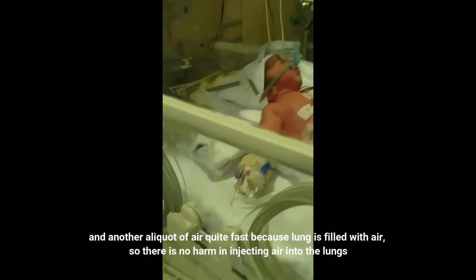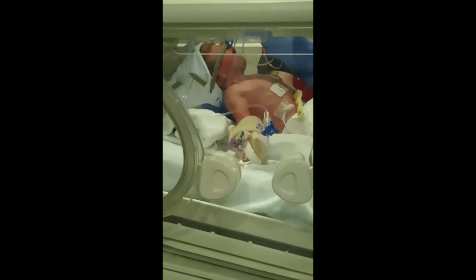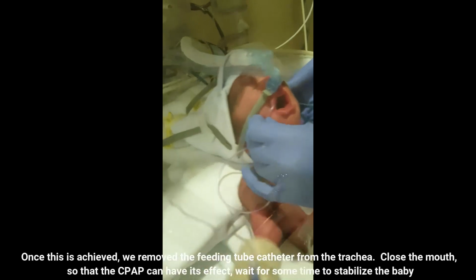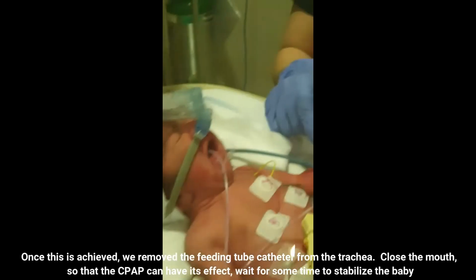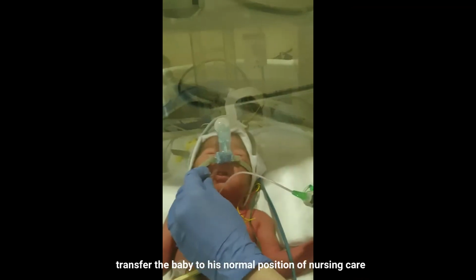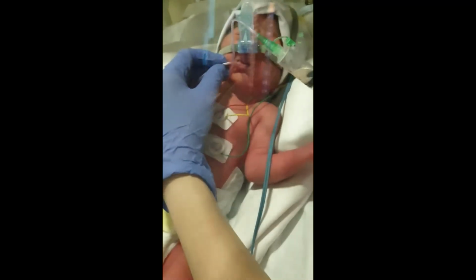But make sure you are not blasting the air into the lungs. As if a baby takes a normal breath, please inject the air. This is to push the Curosurf into the distal airways where its action is needed and to prevent reflux as well. Once this is achieved, we remove the feeding tube catheter from the trachea. Close the mouth so that the CPAP can take effect. Wait for some time to stabilize the baby and then transfer the baby to his normal position of nursing care, and CPAP will be continued in the usual normal position of the baby as before.